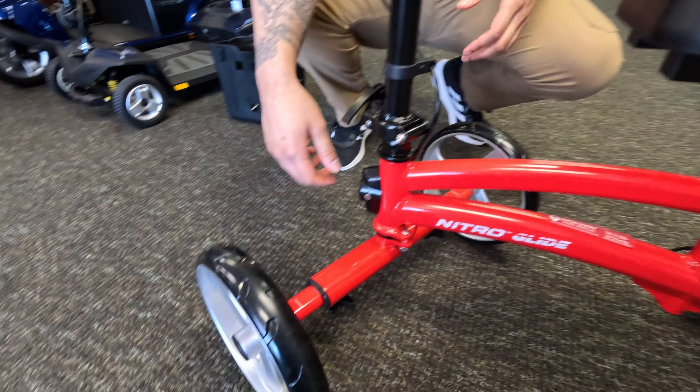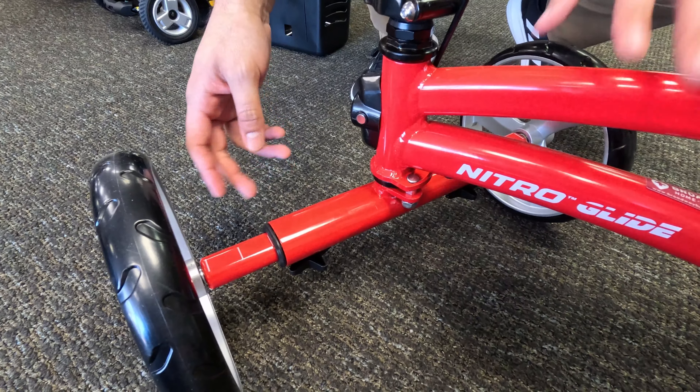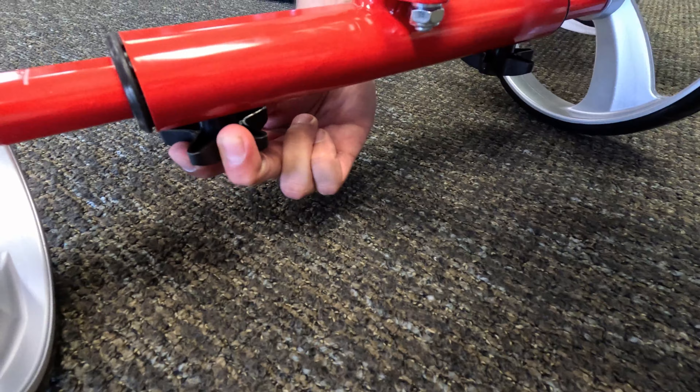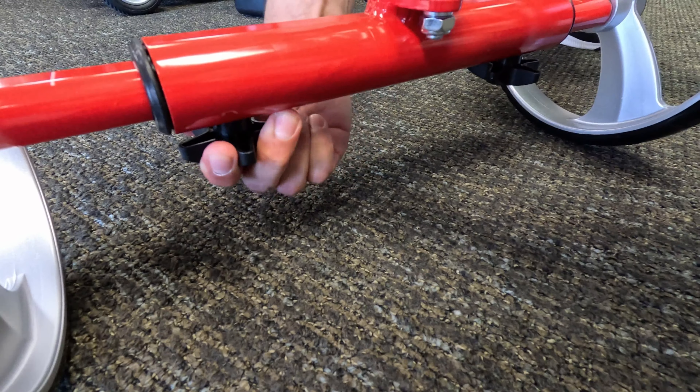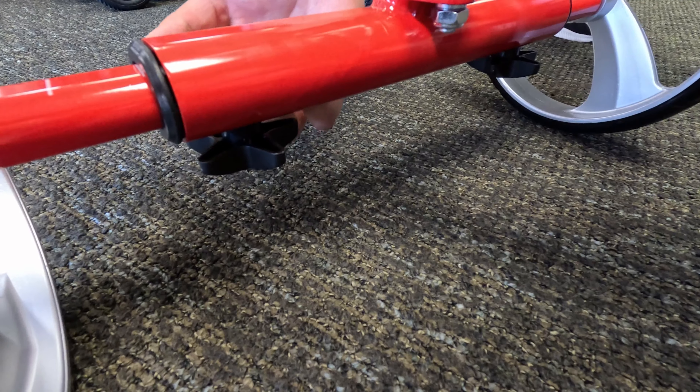Now the width of the axle is able to be adjusted. Right now it is at 20 inches. It does also go down to 18 and 16. All you do is adjust it by loosening to the left, and then you're going to want to swing it back just to get it locked out.